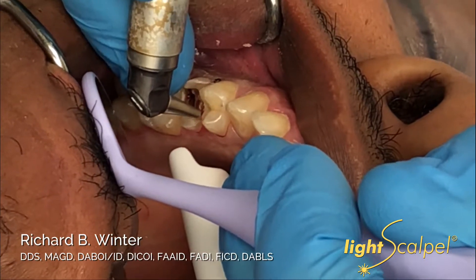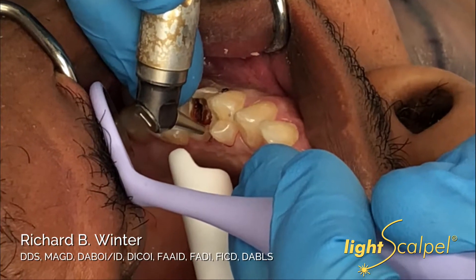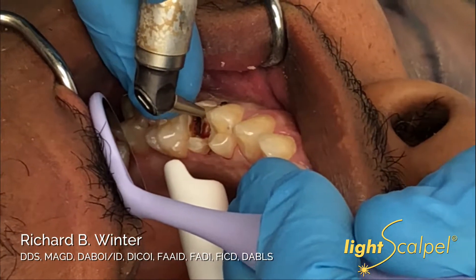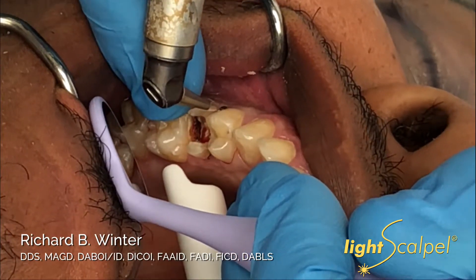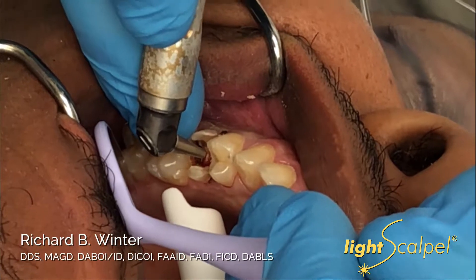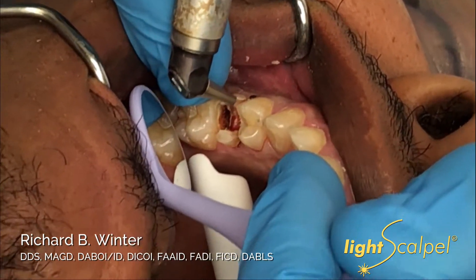Having the proper fluence or hand speed as we're doing this, and just keeping our focal distance about three millimeters away from the tissue that we're working on, seems to be wonderful. When I see a little plume, that lets me know that we're right by the interdental bone — that's how I know when to stop. So we're about right there.